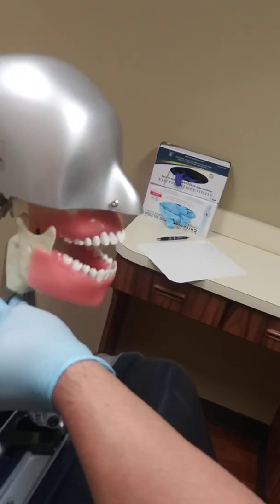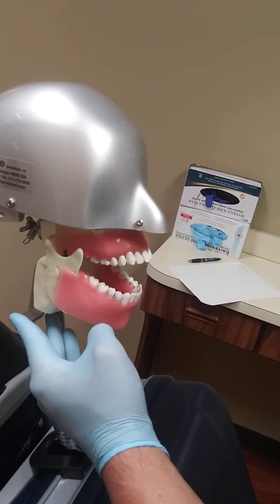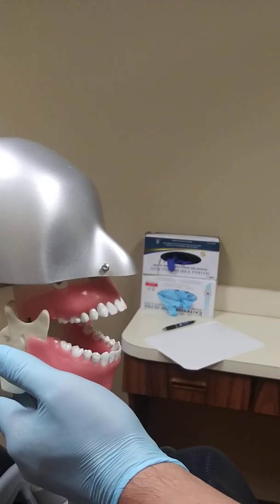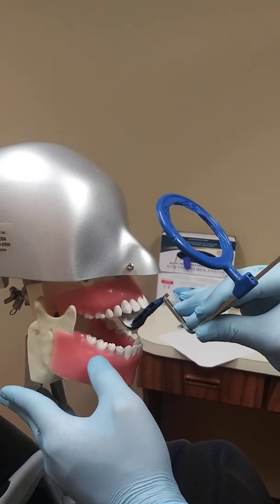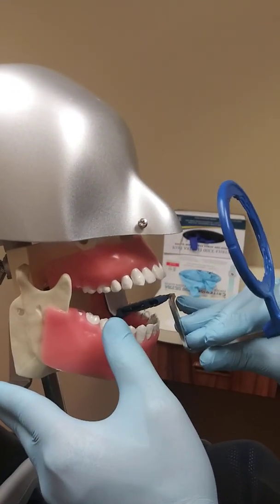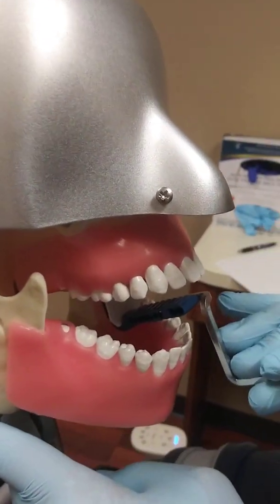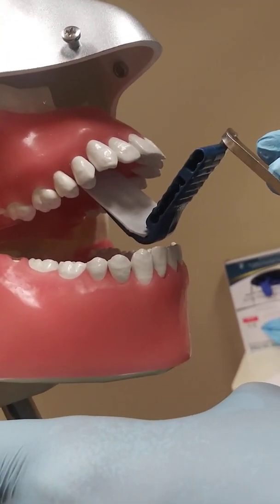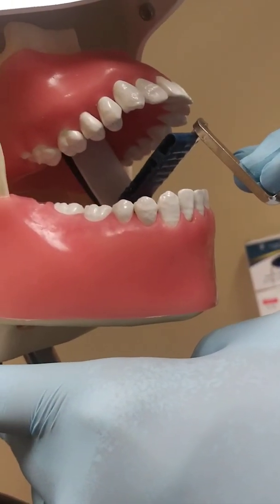So the first thing we would do is ask the patient to open their mouth. Then we place this into the mouth. Now, a lot of students and even personnel who have been working in the dental field forever make this mistake frequently. You don't want to place the film in the mouth and try to get it right up against the tooth. You want to place this as far back into the mouth, toward the center of the mouth and the palate as possible. You want to place this film this far back — not as close as you can to the tooth. You're going to get magnification that way, or you might cut off the incisal edges.